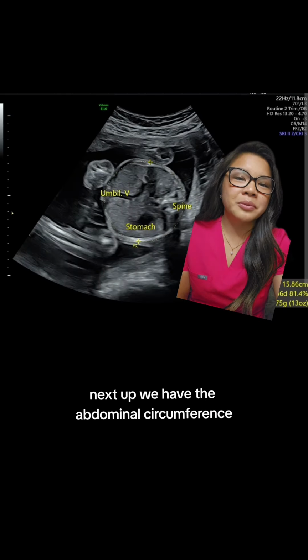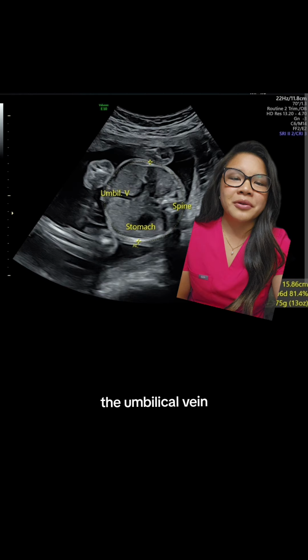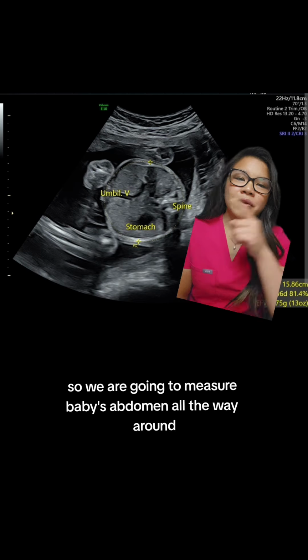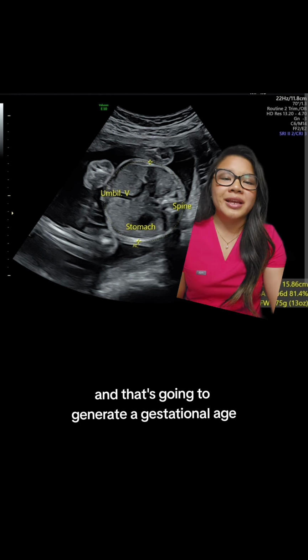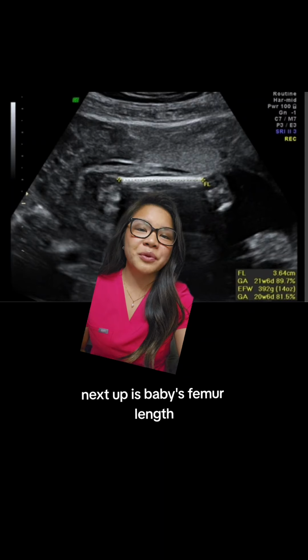Next up, we have the abdominal circumference. On this picture here, they have it really nicely labeled, where they have the stomach labeled, the umbilical vein, as well as the spine. And again, this is a cross section of baby's abdomen, and we are going to do a circumference again. So we are going to measure baby's abdomen all the way around, like that whole big circular thing. And that is going to generate a gestational age, which again, you guys can kind of see down here from this measurement.